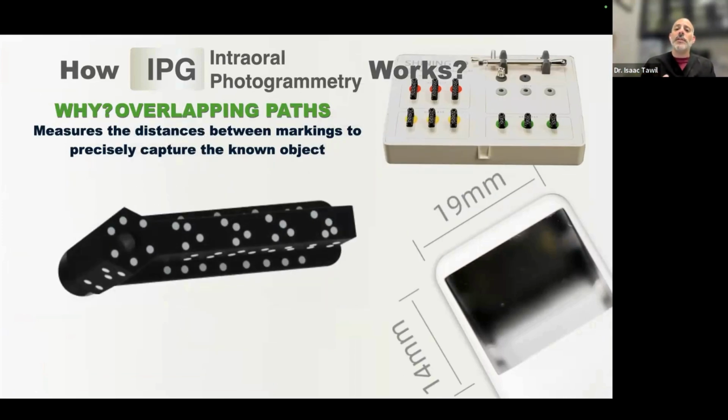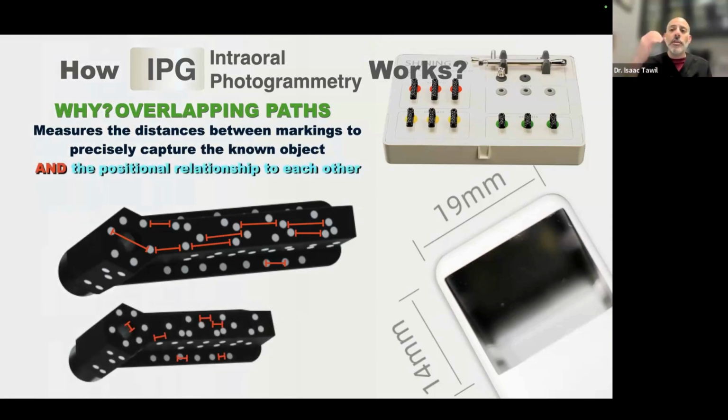And as it's scanning, with the photogrammetry, it's going to measure the distance of the dot and say, hey, I know you. You are A2. A2, I know you, but it won't import it until it sees a neighbor. And when it sees its neighbor, it'll say, hey, I know that you're C3. So A2 and C3, I know you're there. But what I have to figure out is what is your distance between each other? And so now the last step of this before it will import it into the software is it'll make sure it has enough data between these implants, between these multi-units or scan bodies, and it will only populate once it knows the actual distance.